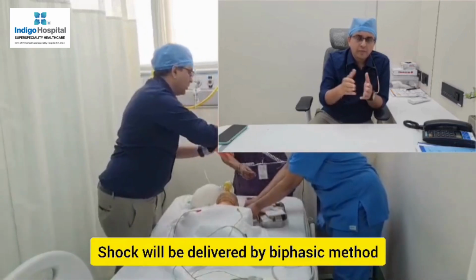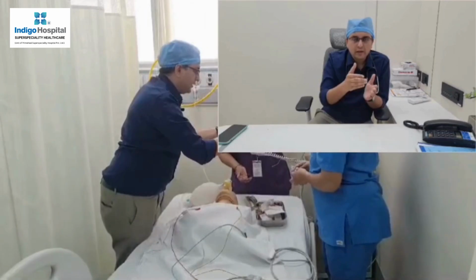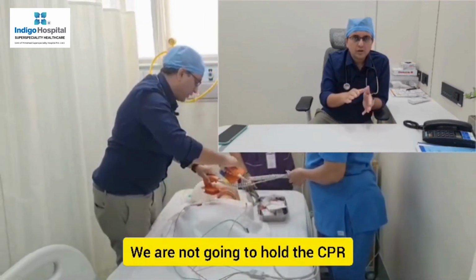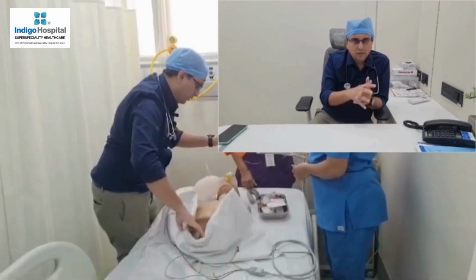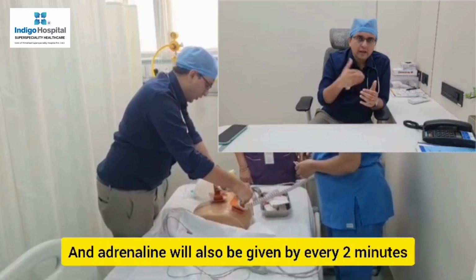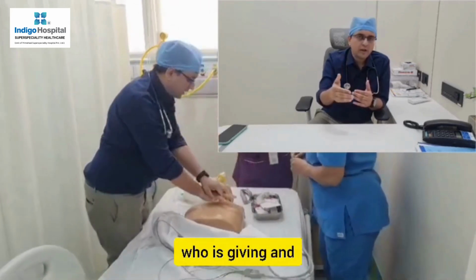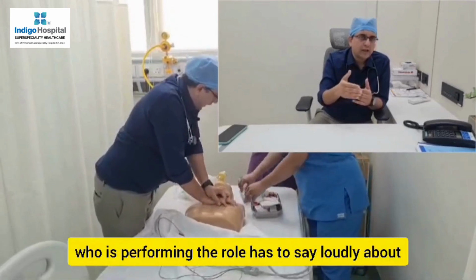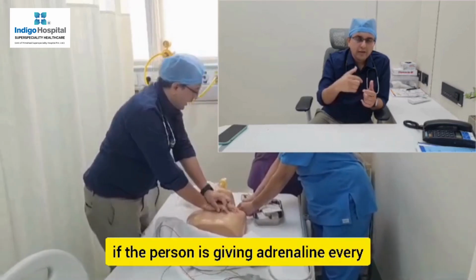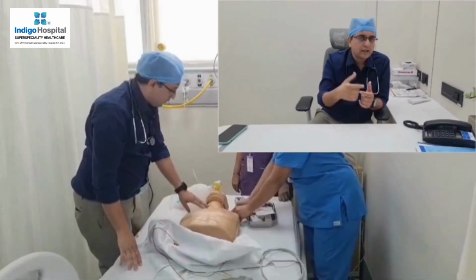The shock will be delivered by the biphasic method. We will give a 200 joule shock, and immediately we'll resume CPR. We are not going to hold the CPR after the shock. Immediately CPR has to be resumed, and adrenaline will also be given every 2 minutes. Each person who is performing a role has to say loudly what they are performing. If the person is giving adrenaline, every 2 minutes he has to give 1 milligram of adrenaline and say that it is delivered.